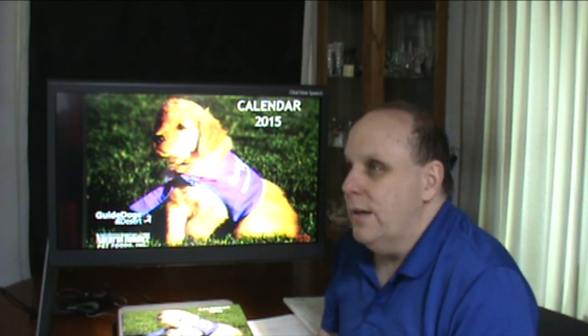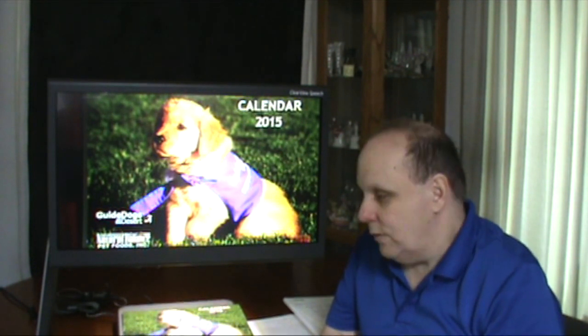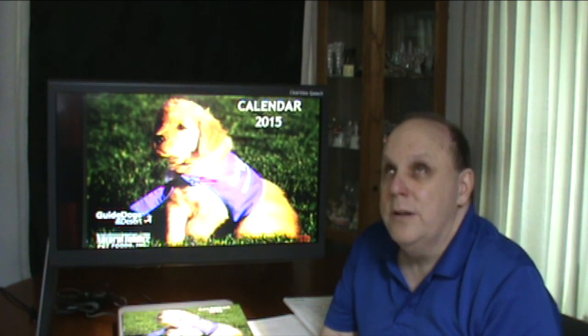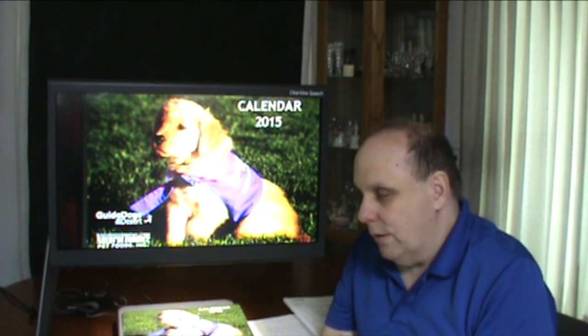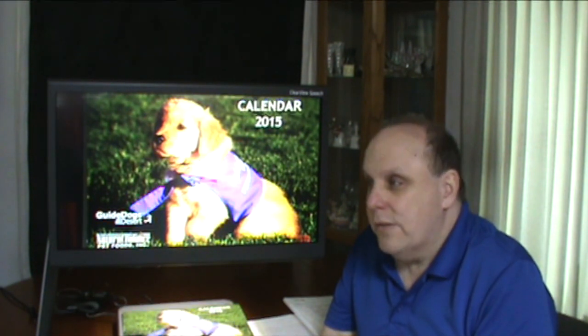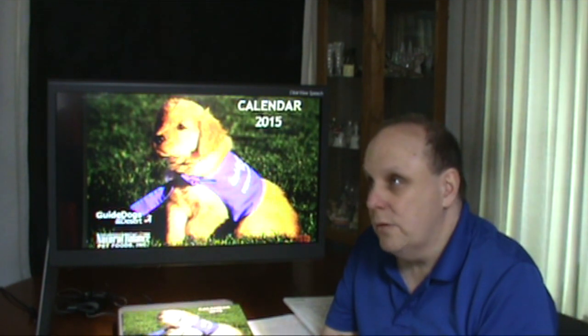Anyway, we're going to take a look at this video magnifier today. Now you're probably wondering, what's a video magnifier? Well, before we get into describing the unit to you and everything else, a video magnifier is simply a device that will allow printed or pictured text, if you will, to be enlarged. And that's what this device does. It will basically enlarge either pictures or text.